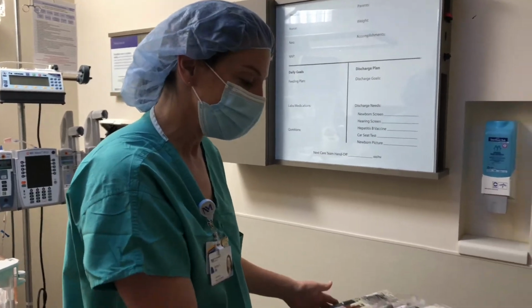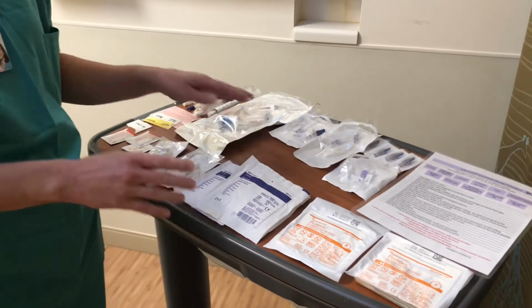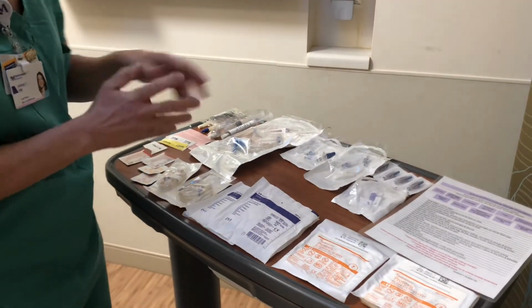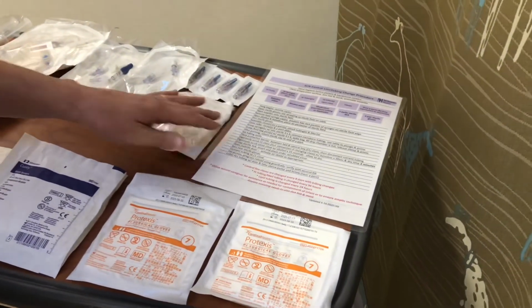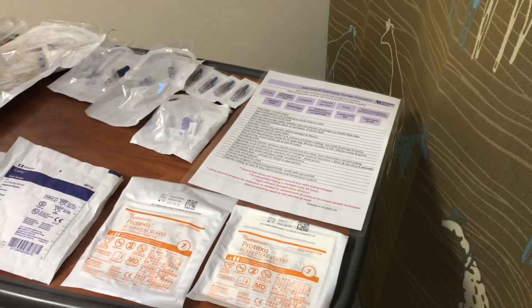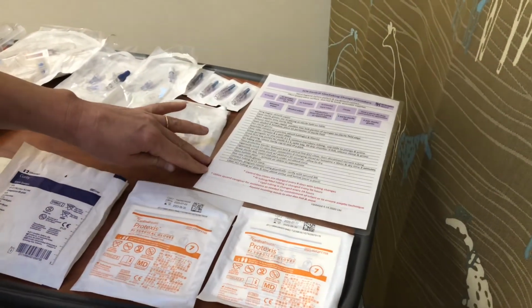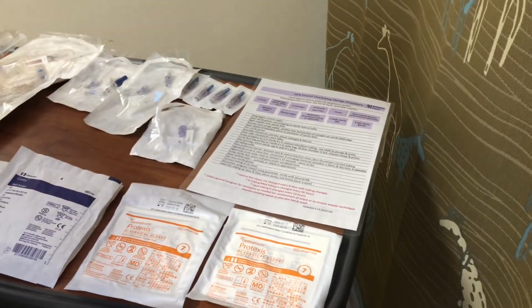And then we want you to clean your preparation surface first, and then don your hat and mask and assemble your supplies. You'll see we have this new laminated reference card for you that's located on all of the IV pumps, and I've put one at the bedside here to kind of assist me in my procedure. This has all the supplies that you'll need.